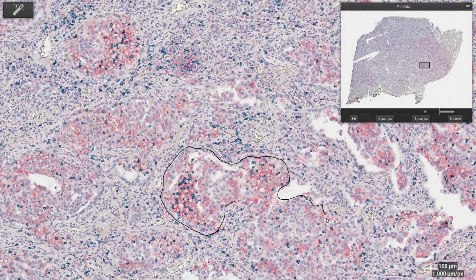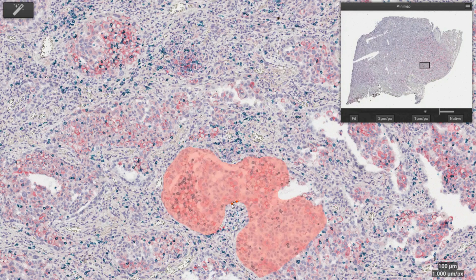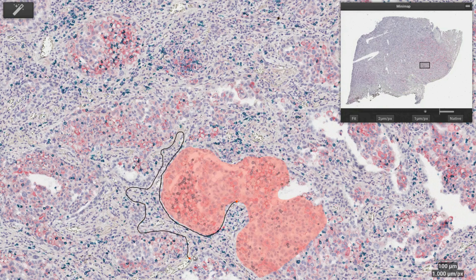The pathologists provide their unique expertise in a convenient way by providing example regions for the different tissue types to then train the system on the fly. Here we outline one region with tumor cells and two regions with cells in the tumor microenvironment.